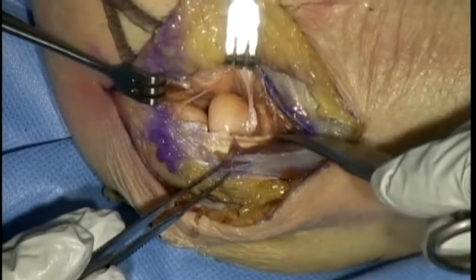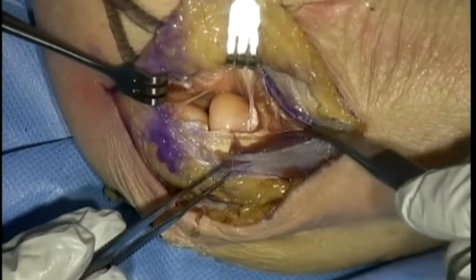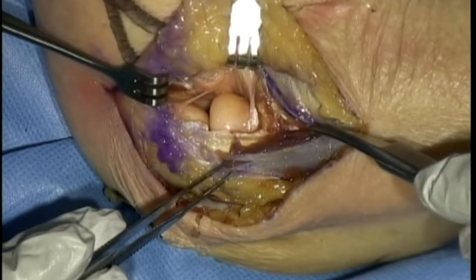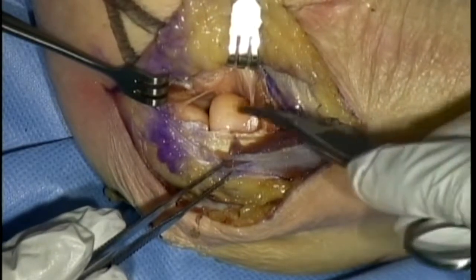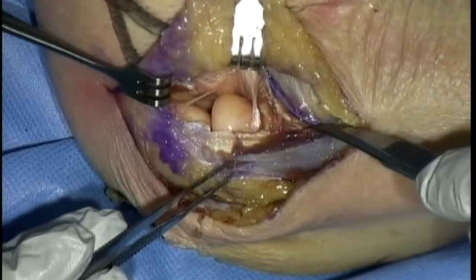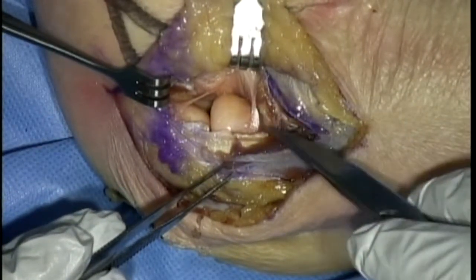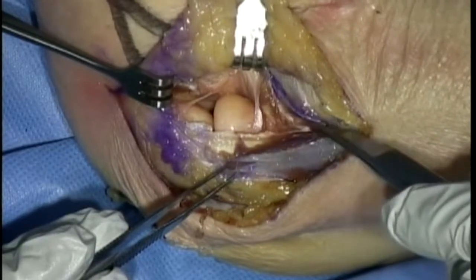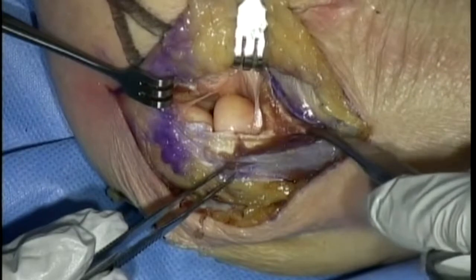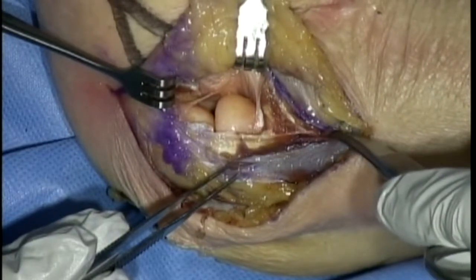Hans reminded me to mention this. As you go down to the radial neck, you're going to get into the fibers of the posterior interosseous nerve. So if you have to put a plate on, like a radial neck plate, you're going to have to dissect those nerve branches out down here, which are just very wispy, there's not much to them. You're going to have to start dissecting them out down about this level here. You've got about 1 centimeter from the neck, which is safe. Beyond that, you have to worry about it.